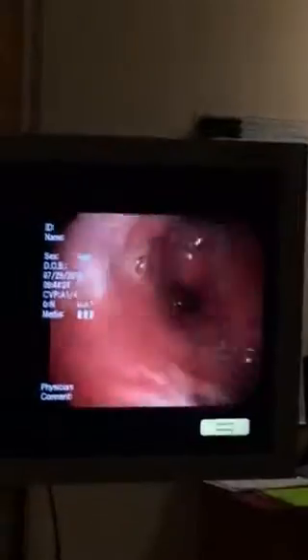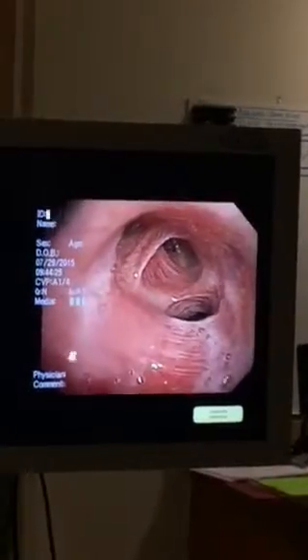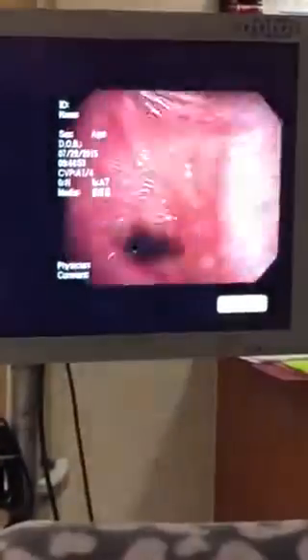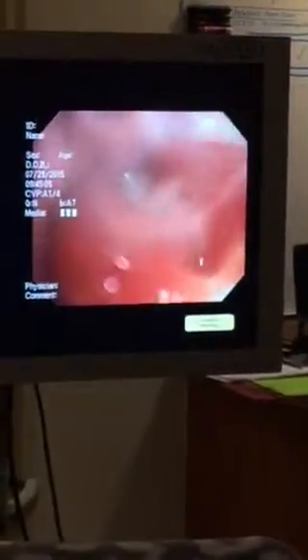Alright. Okay, lidocaine left upper lobe, please. Ready for a blood? Yeah, lidocaine. Lidocaine. Get her numbed up, and I'm going to clear out some of the secretions, and then we'll get down to lavage. The other area that's bad is the middle part of the left lower lobe. Now we have the left upper lobe. Superior segment, left lower, and then here's the basal segment. Those areas are really damaged. You can see there's a lot of pus.